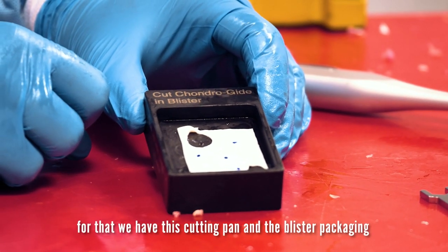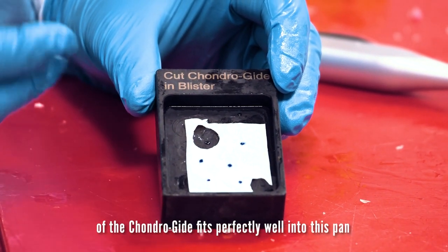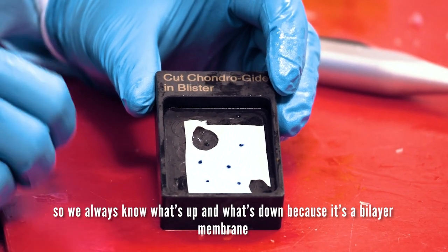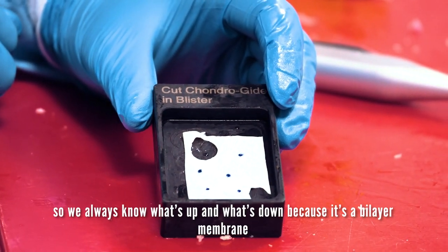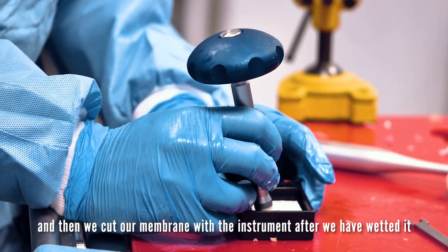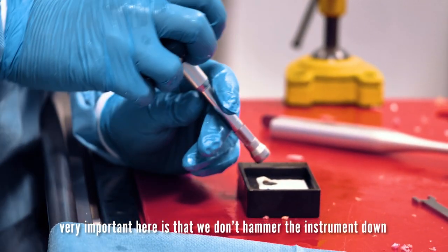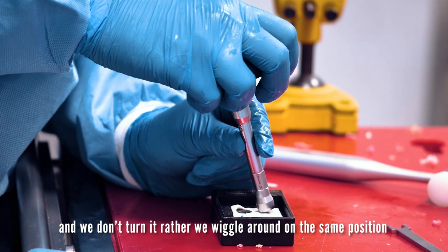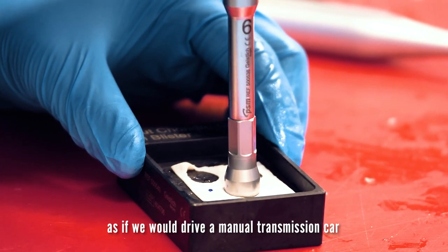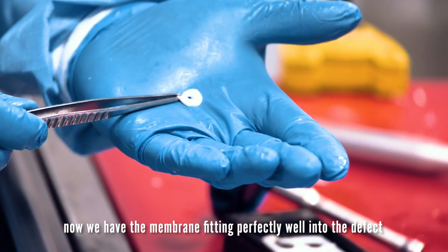We have to prepare the membrane now. For that we have this cutting pan, and the blister packaging of the Chondro-Gide fits perfectly into this pan. It is very important to mark it so we always know what's up and what's down, because it's a bilayer membrane. Then we have the membrane cutter — it's very sharp — and we cut our membrane with the instrument after we have wetted it. Very important here is that we don't hammer the instrument down and we don't turn it; rather we wiggle around in the same position, as if driving a manual transmission. Now we have the membrane fitting perfectly into the defect.